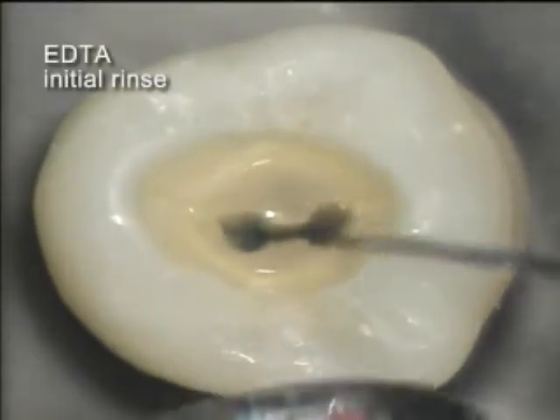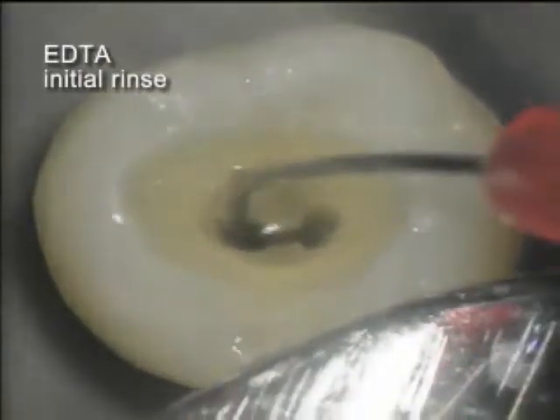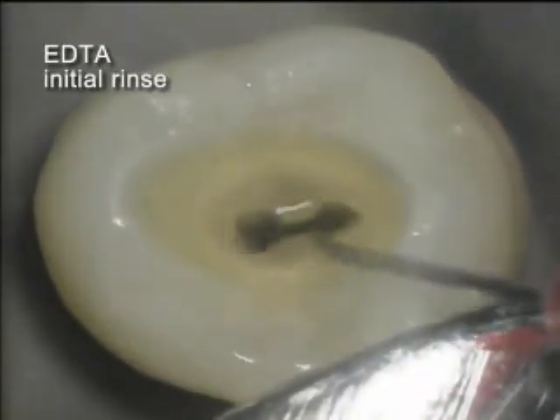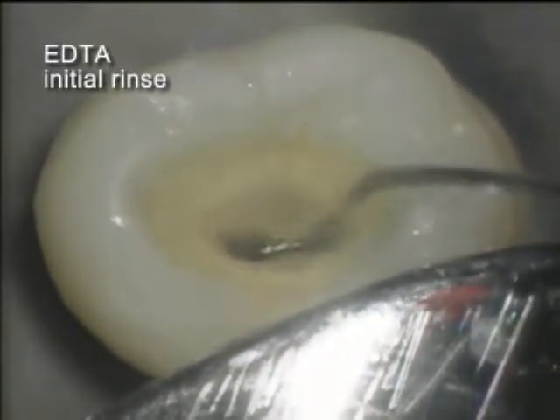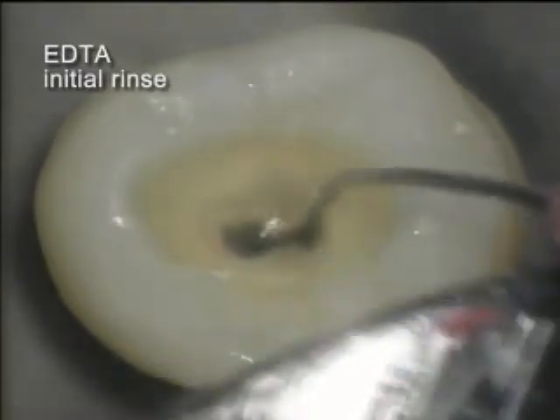A 17% EDTA solution is introduced using a 28-gauge side-vented needle after the sodium hypochlorite. Suction evacuation is being used, but no debris materials are seen. The currently accepted protocol for endodontic usage of EDTA is a one to two minute soak before another rinse and evacuation.